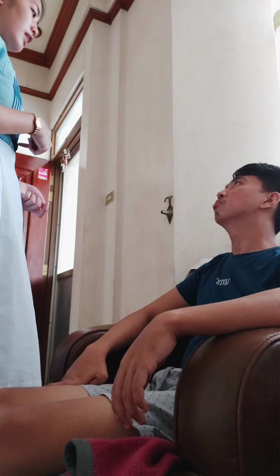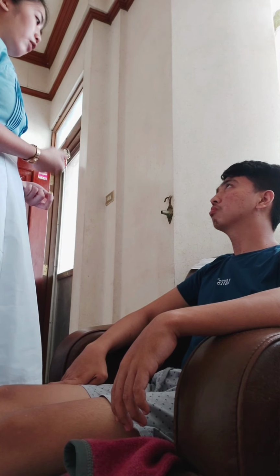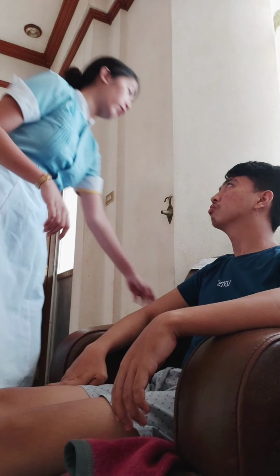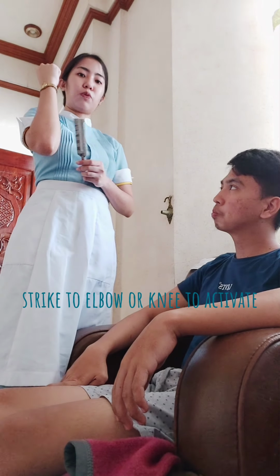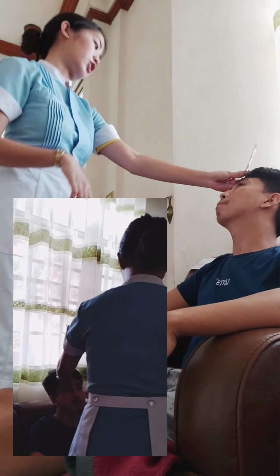To perform Weber's test, strike the fork against your knee or elbow. Then place the base of the fork in the midline, high on the patient's forehead. So this is the tuning fork. I'll strike it on my elbow. Then I'll place it in the midline of the forehead of the patient.